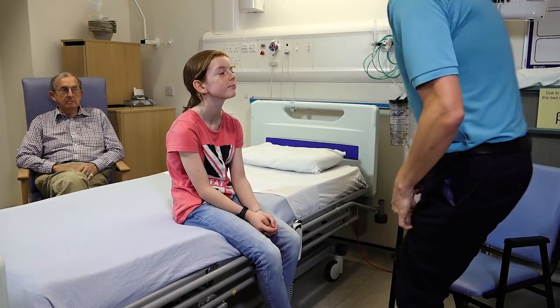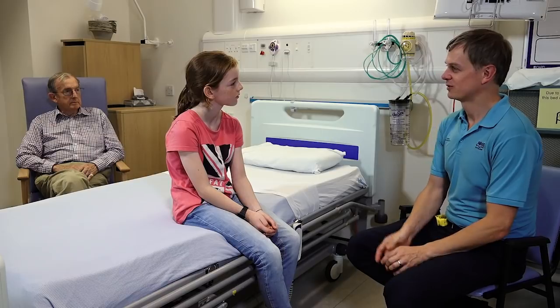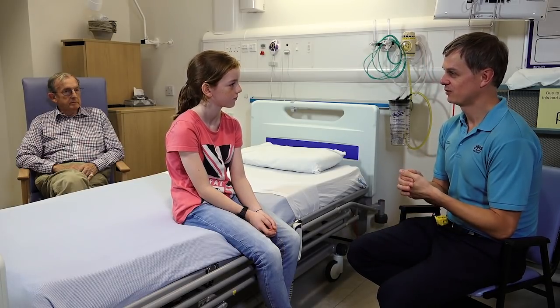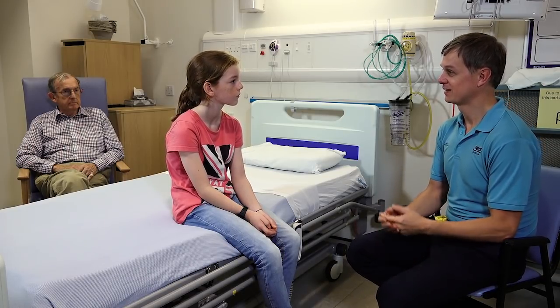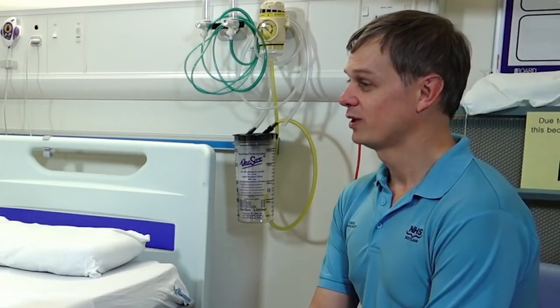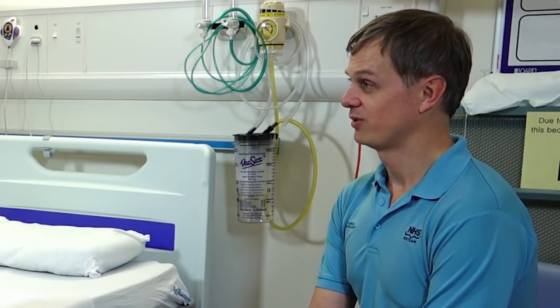Hi Lizzy, I'm Andrew and we're going to show everyone how we do the actual sleep test itself. I understand you've met the nurse who showed you how to do the height and weight, and you've met the doctor who checked that you're okay and there are no coughs or colds that could affect the test. Now I'm going to get the equipment to show you how we do the test itself, so if you get changed and ready for sleep, I'll get all the equipment and we can set it all up.